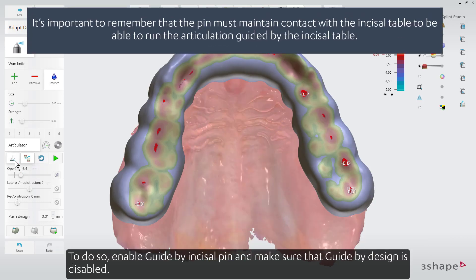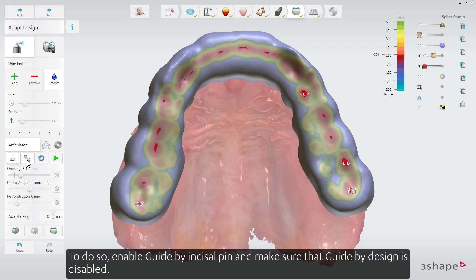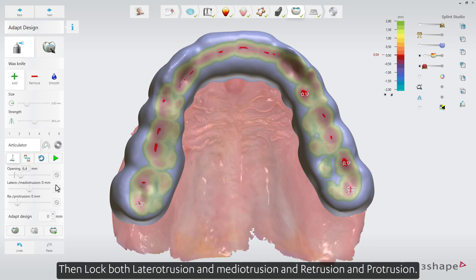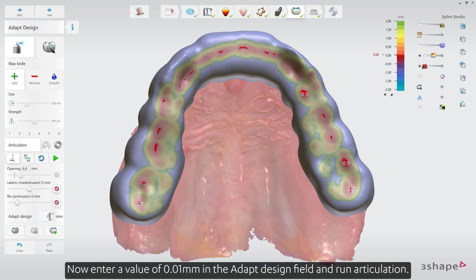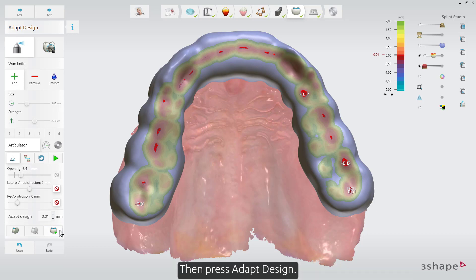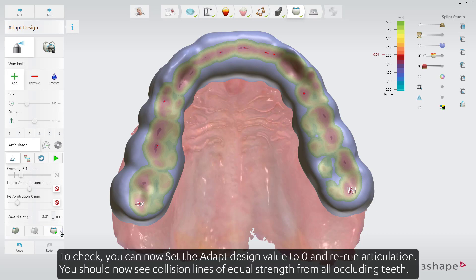To re-establish static contacts: enable guide by incisal pin and make sure that guide by design is disabled. Then lock both laterotrusion and mediotrusion and retrusion and protrusion. Enter a value of 0.01 mm in the Adapt Design field and run articulation. Then press Adapt Design. To check, set the Adapt Design value to 0 and re-run articulation. You should now see collision lines of equal strength from all occluding teeth.